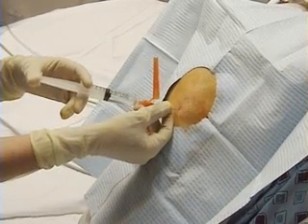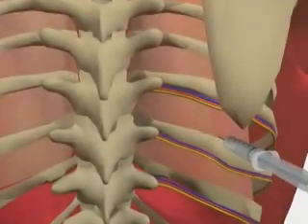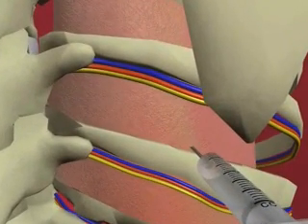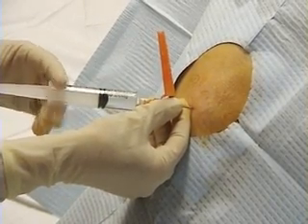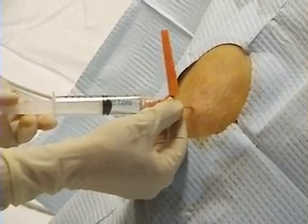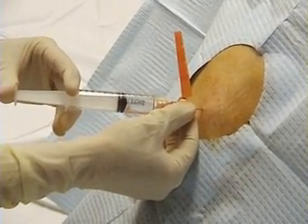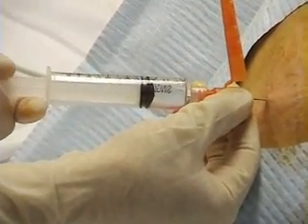Switch to a 22 gauge needle and begin to anesthetize the deeper tissues. The inferior surface of the rib must be avoided, since the intercostal vessels and nerve are located in this region. Walk the needle over the superior aspect of the rib, alternately injecting anesthetic and pulling back on the plunger as you advance. Once the needle enters the pleural space, pleural fluid will begin to fill the syringe.